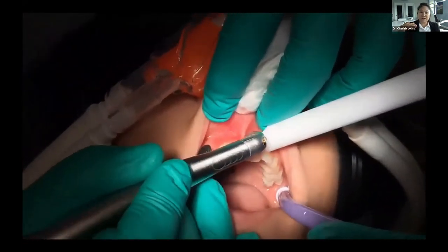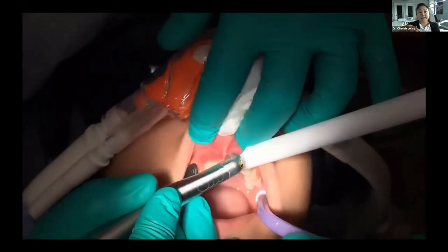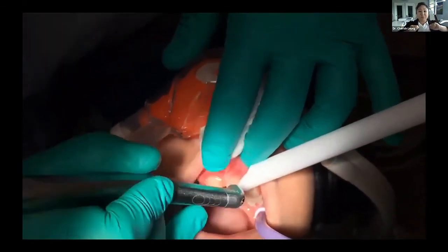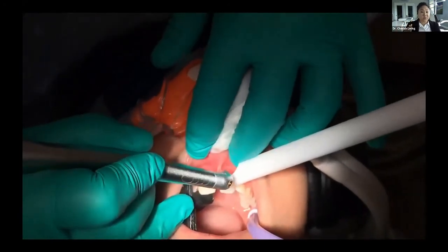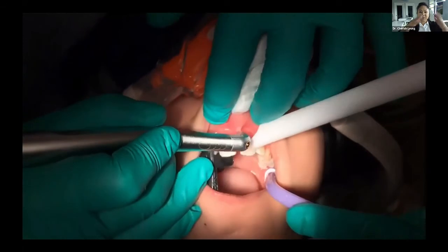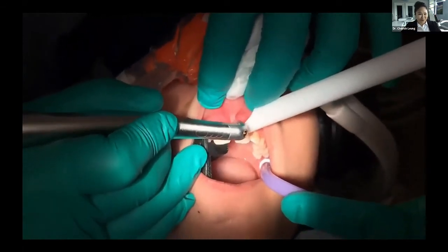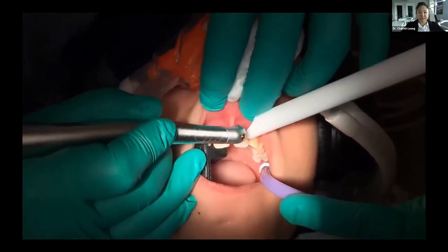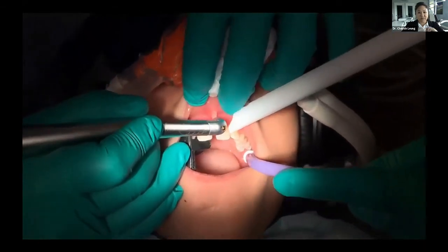Some of the videos show starting at a different area, but I find that that's the easiest because you'll really start to feel the pull, and you can really start to extend the lip so you can see where you need to provide that horizontal cut for the full release. So here we're doing the vertical cut. Don't worry, we'll talk more about this soon. Here we're doing the vertical incision, releasing all of those tissues.